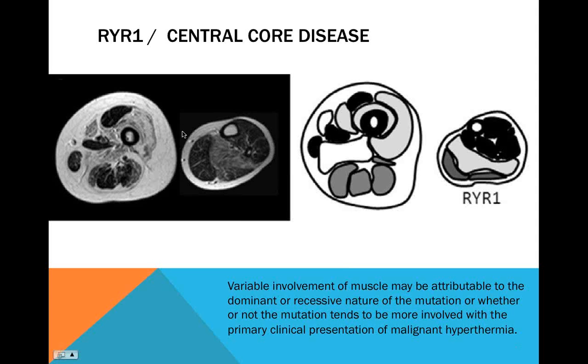So this is the actual MRI that's being shown. This is a T1 image, and this is a schematic, or a drawing, of the pattern that has been recognized. This is from a TREAT-NMD consensus statement paper, which I found to be very informative. Although more information can be provided, hopefully I can gather some of this information while I'm completing my fellowship here to put it all together.